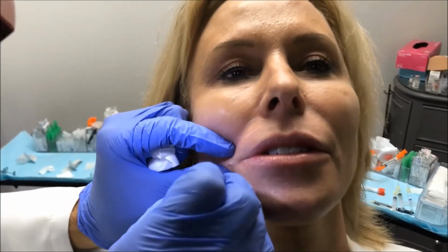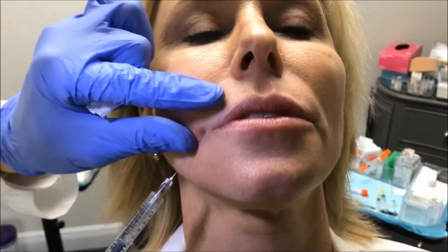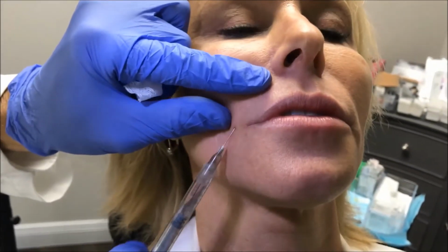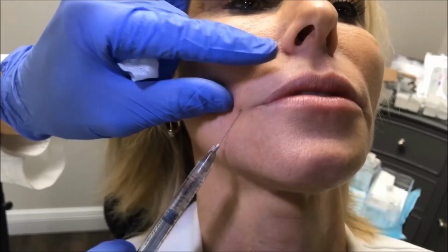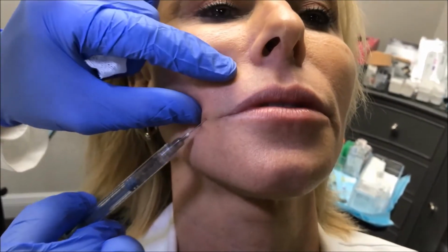And it didn't take that much volume to do that whole area. We did half a syringe, 0.5 milliliters of Juvederm Ultra Plus 50-50 blend. When we say 50-50 blend, what that refers to is we take one syringe of Juvederm Ultra Plus, which is 1 milliliter, and we take 1 milliliter of lidocaine without epinephrine, 1% lidocaine, and we mix the two together. So now that 1 milliliter is 2, and it's blended 50-50, so it makes it a little thinner. Almost like prehydrating a sponge. So people are going to be less likely to puff up after the treatment.